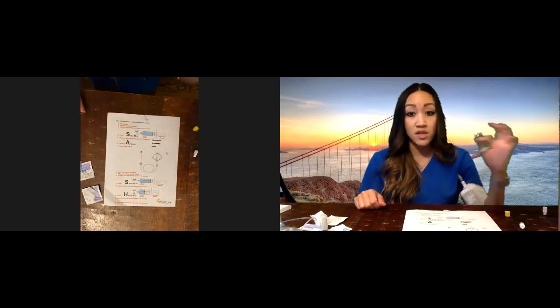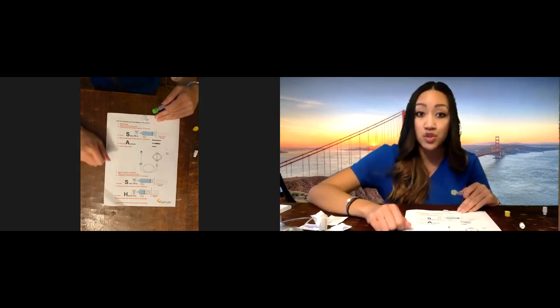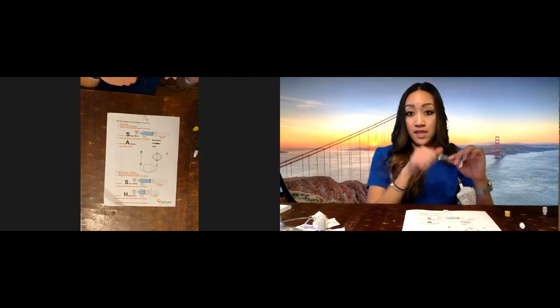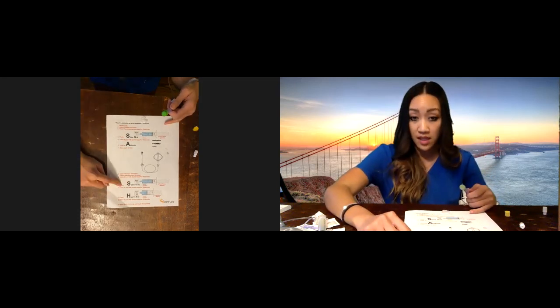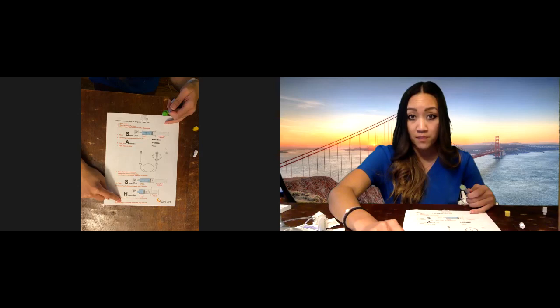If you have more than one IV, you definitely want to flush the other IV line. To flush the other IV line, grab the saline and another heparin and go through the same steps: go to your second line, take the cap off, clean it for 15 seconds, flush the saline, clean for 15 seconds, flush the heparin, clean for 15 seconds, and apply a brand new green cap.